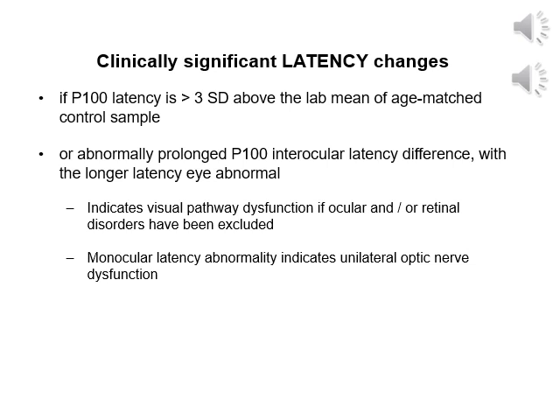In our lab, we use the standard of 3 standard deviations above the mean for an age group before we call a VEP abnormal. And so 3 standard deviations is quite generous and encompasses about 99% of the population. In adult labs, 2.5 standard deviations is the typical cutoff that's used.